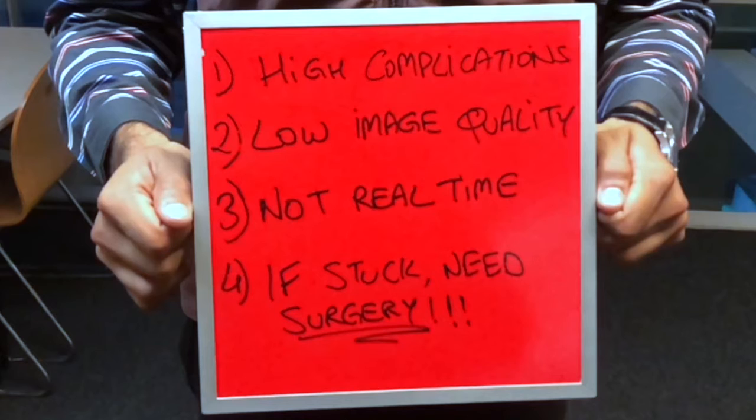so we get very low quality images. Basically, how capsule endoscopy works is that the capsule is swallowed by a patient and it travels through the whole GI tract of the patient and stays in the body for almost 8 hours. After 8 hours it is removed from the body and connected with the computer to obtain the details, so it is not giving us real-time data.